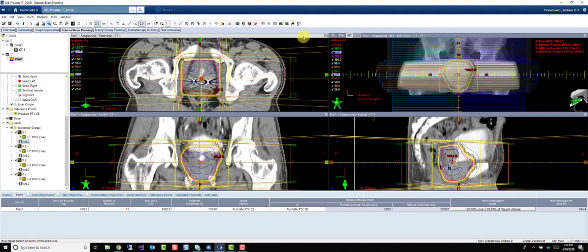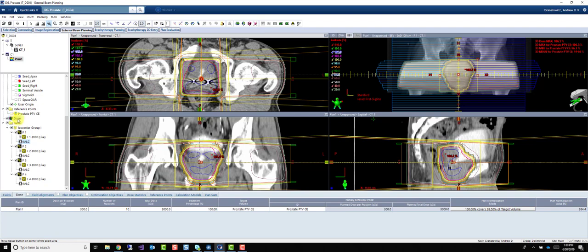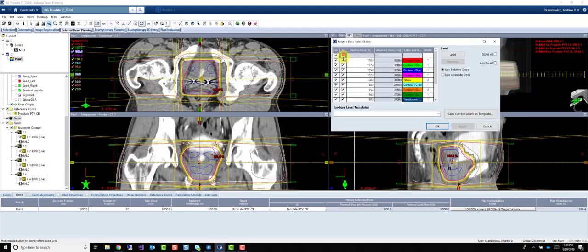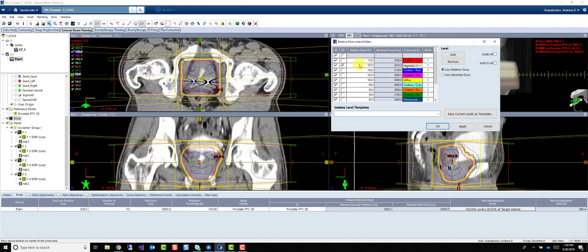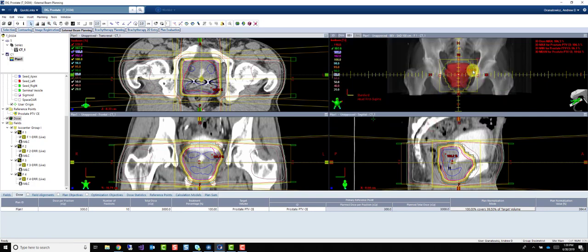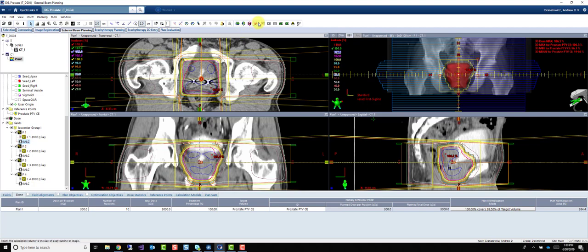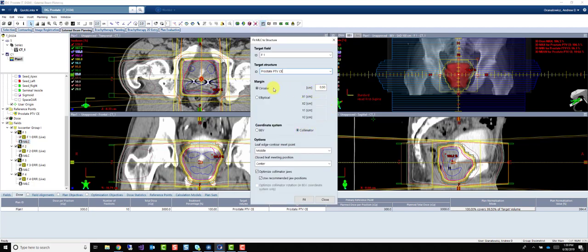So we went with a 0.5 CM margin. Let me get rid of these dose clouds. I'm going to leave that 107 on. I'm going to turn it to a segment. I'm going to leave this one on, because in the end, what my goal is for 3D plans, most 3D plans, is to get my hotspot below 107. So eventually, we're going to have to use that to create our field-in-fields. So we went with the 0.5 CM margin. Let's decrease that to 0.3.